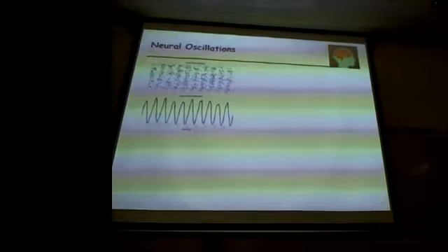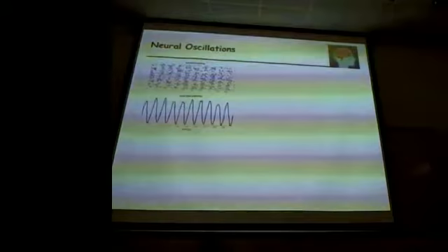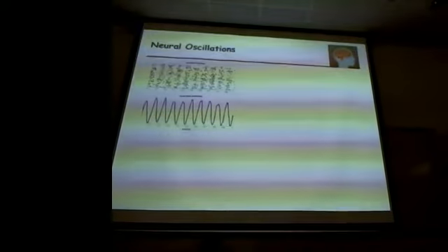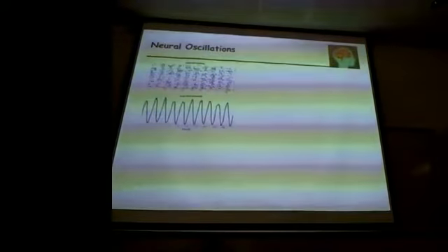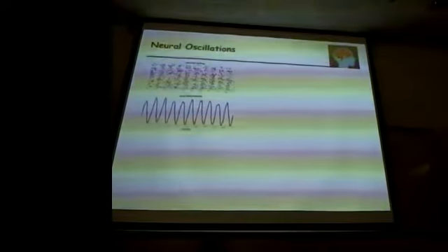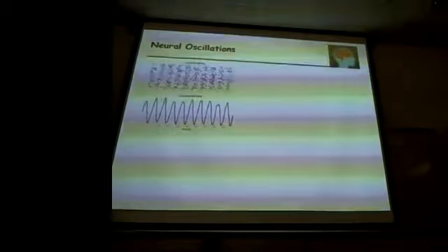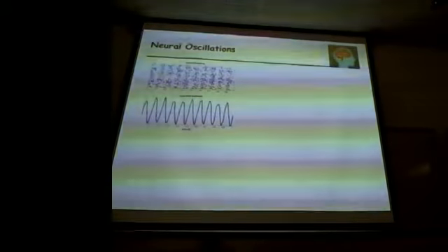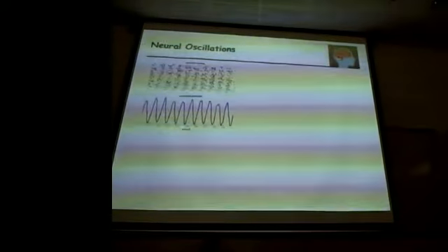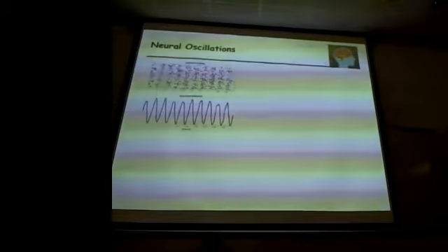So what I've shown you so far is evoked responses, so you present a stimulus and you look at the response. The other thing that we can look at, because what we really have is a time series that we're collecting from each sensor, is neural oscillation. The neural oscillations that we're looking at with MEG and EEG have a fairly good direct connection to the physiology in the brain, right? So you can actually see that there are periods where neuronal spiking is gated, for example, and if you look at the summed response, then you can get these neural oscillations because of the gating of that neural spiking.